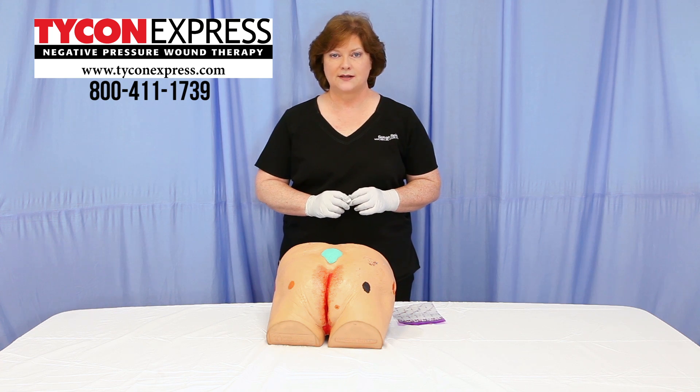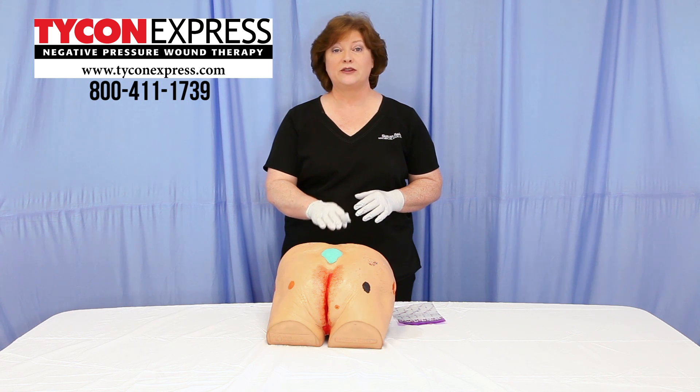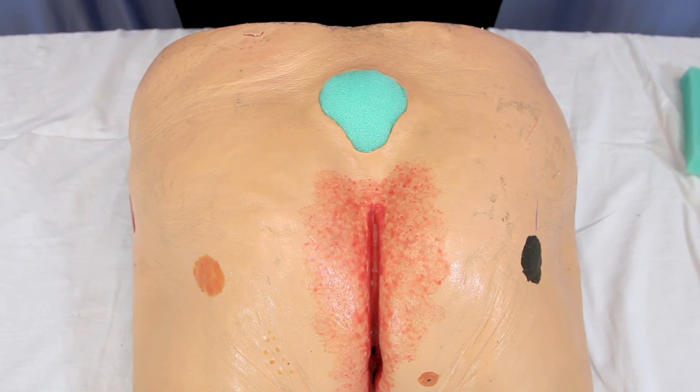Susan Reed for Tycon Express. Today we're going to discuss briefly difficult-to-dress wounds and difficulty with dressing adherence. There may be an occasion where a wound is difficult to obtain a seal when the patient has moist skin or the wound location is in an area prone to moisture. Should this situation be encountered, there's a crusting technique that may be helpful to assist in dressing adhesion.